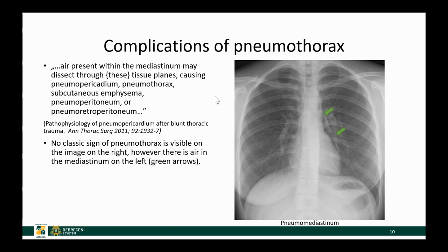Air within the pleural space can theoretically dissect into the mediastinum, from where it can get into the peritoneal cavity and even the retroperitoneum, or it can rise up into the neck area. Here is a case illustrating that: the patient suffered a pneumothorax but there is no visible white line on either side. What I do see, highlighted with green arrows, are linear transparencies over the mediastinum indicating air within the mediastinum — a complication of pneumothorax. This patient probably needs a CT to confirm and assess the size.